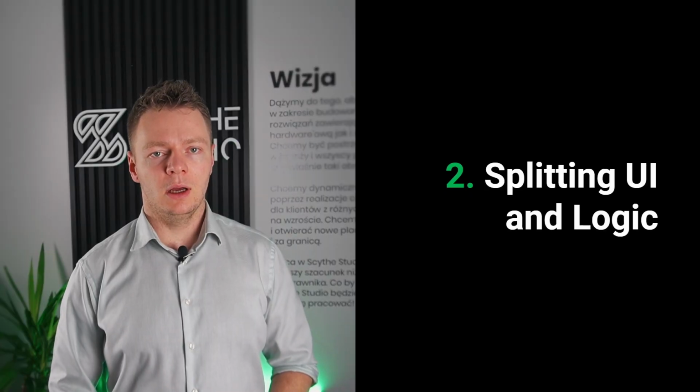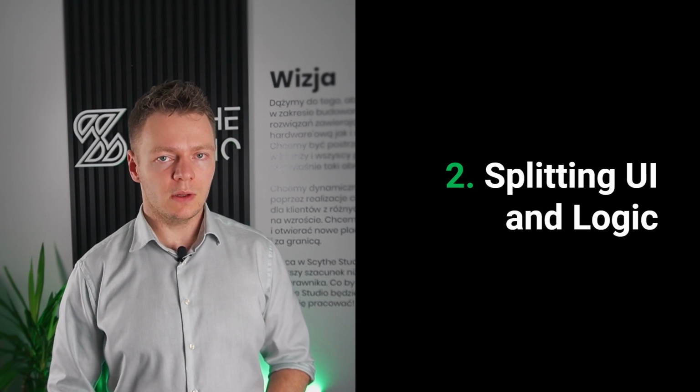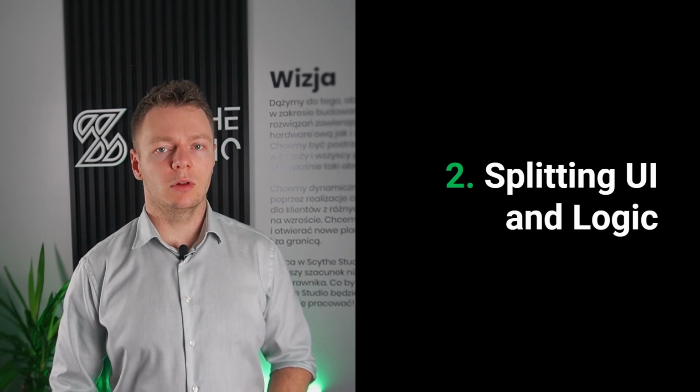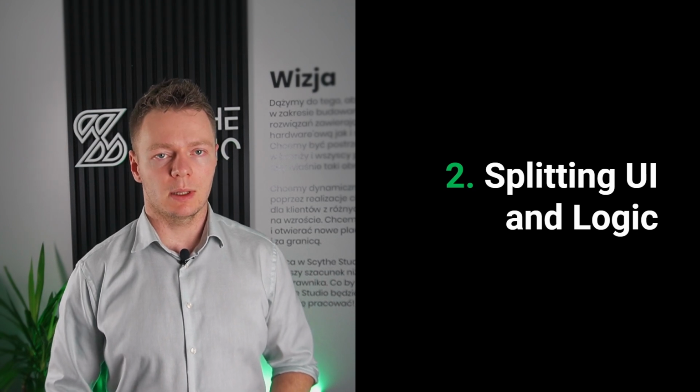The next thing is that if your device has a user interface, then you would most likely code it using Qt Quick, a module of Qt that is designed to develop GUIs using other programming languages than C++. It integrates really nicely with C++ in a way, but still, due to the fact that it's a separate language, it creates kind of a division between your logic code, hardware controllers, and GUI.